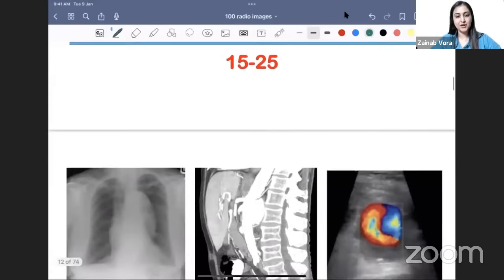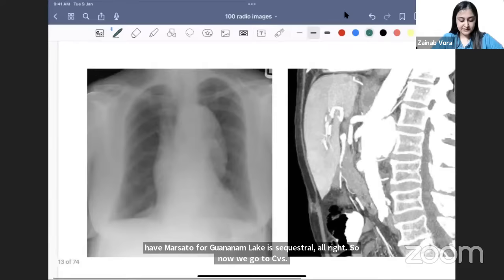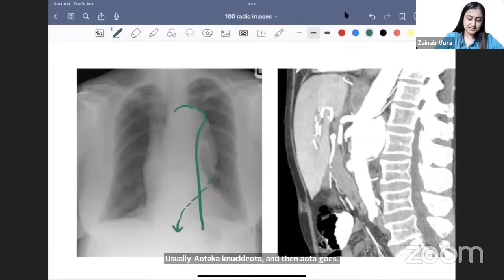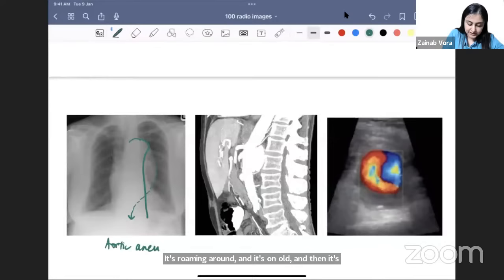Moving to CVS radiology — 10 images, same diagnosis but different parts. On the first chest X-ray, normally the aorta goes straight, but here it is tortuous and uncoiled — this is a thoracic aortic aneurysm of the descending thoracic aorta. On a CT sagittal image, the abdominal aorta has focally widened — this is an abdominal aortic aneurysm, which is the most common site of aortic aneurysm.